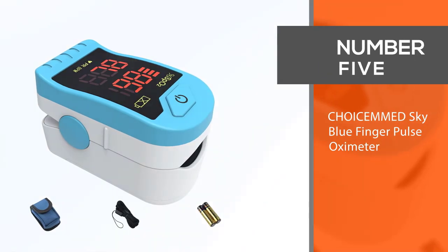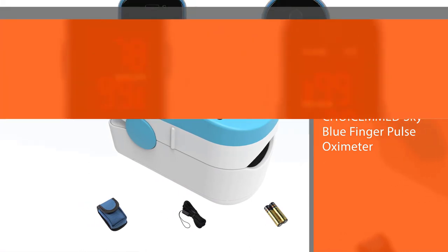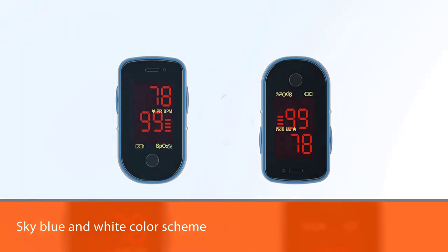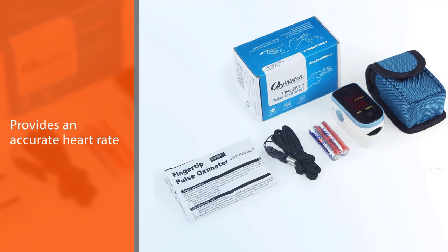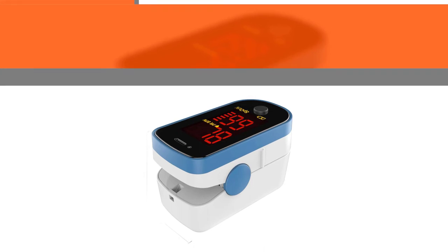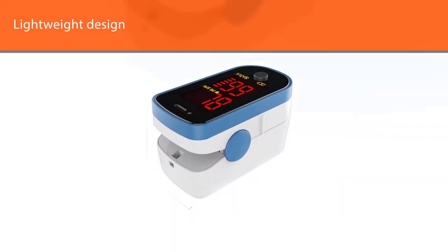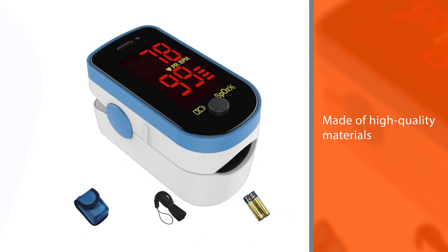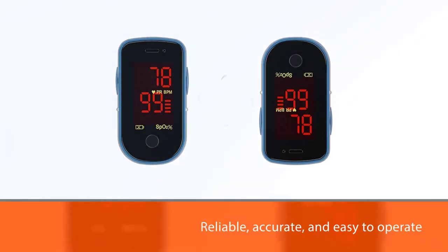Number 5. Choysomed Sky Blue Finger Pulse Oximeter. The Choysomed finger pulse oximeter comes in a beautiful sky blue and white color scheme. This device measures quickly and provides an accurate heart rate and oxygen saturation reading in seconds. One thing that stands out about this model is how lightweight it feels. Even though it feels light, the device is made of high quality materials and actually has good durability. This model is reliable, accurate, and easy to operate. It's suitable for all ages and arrives out of the box ready for use.